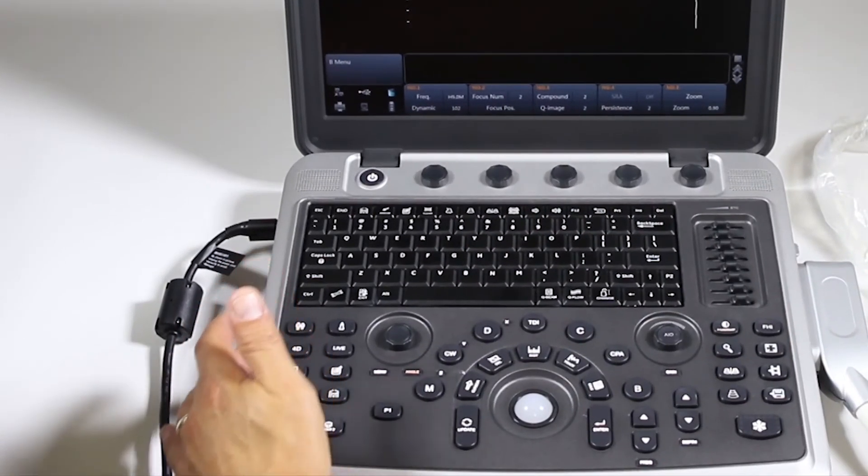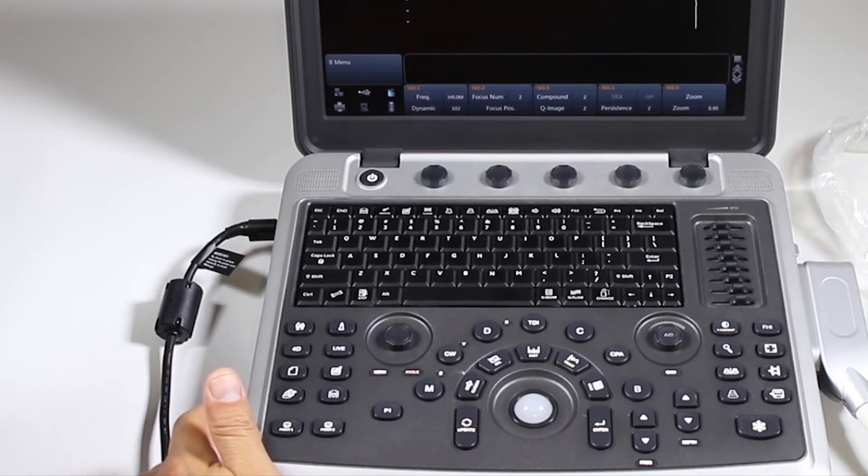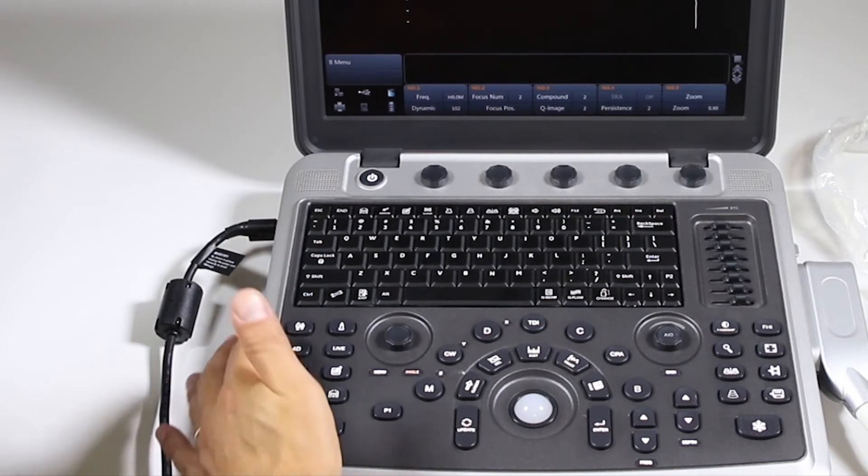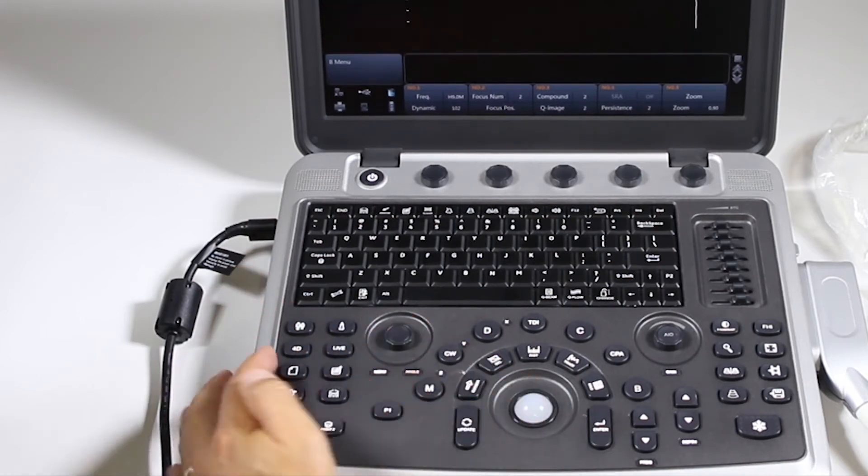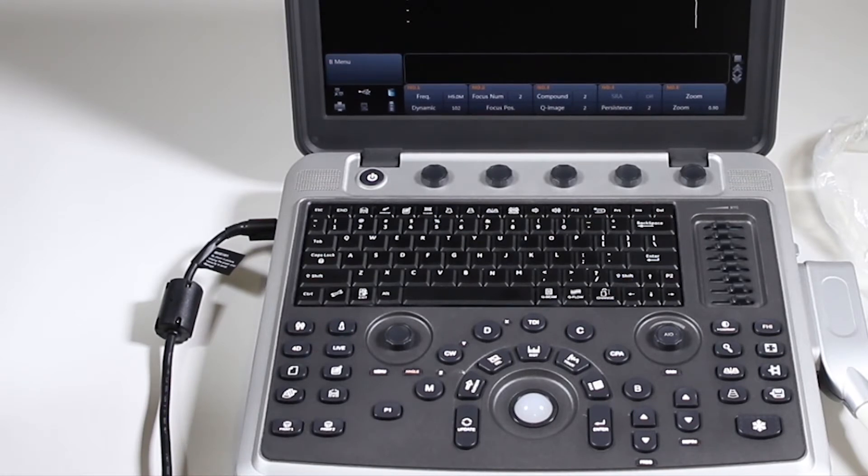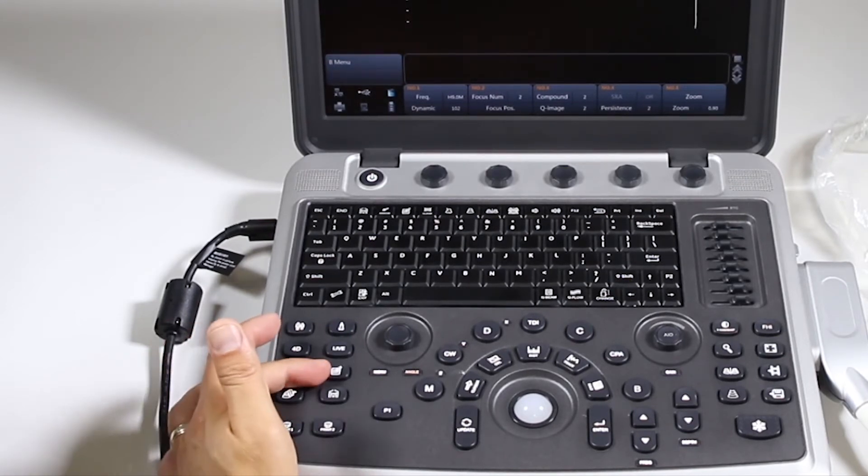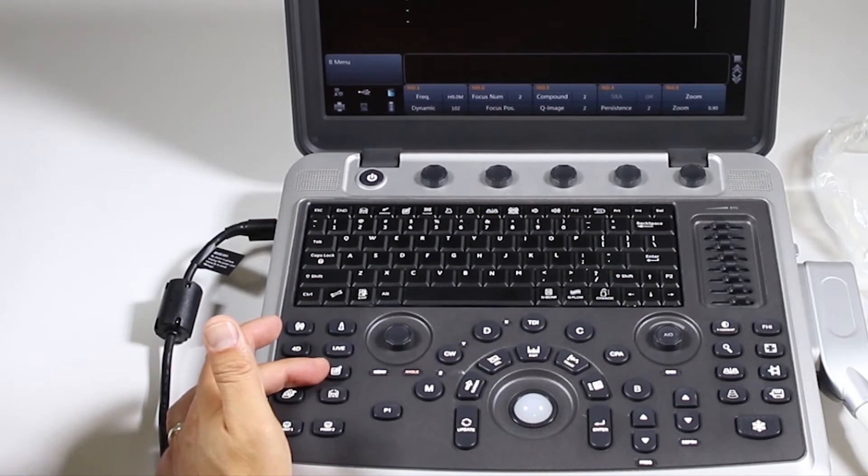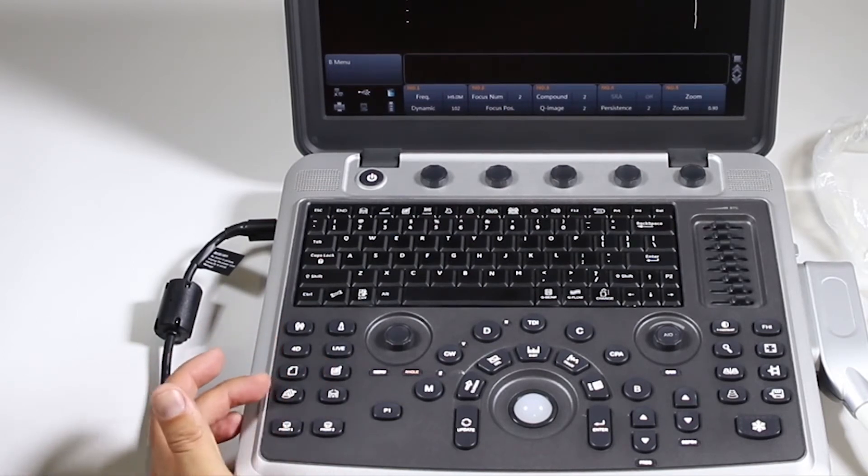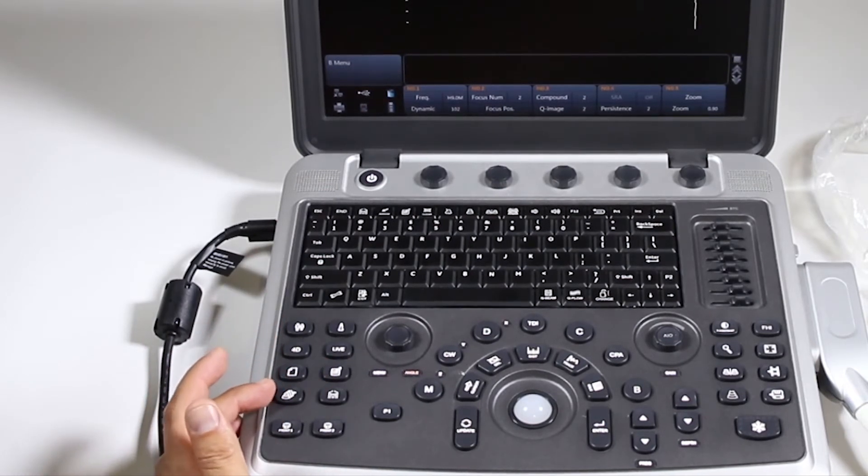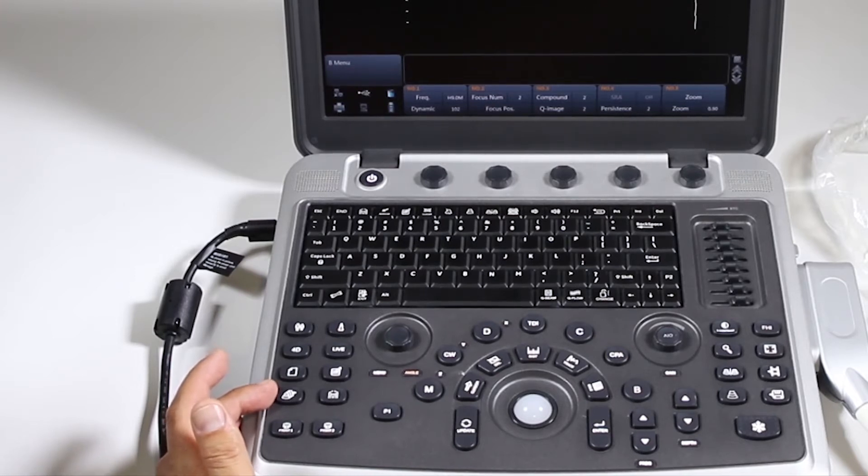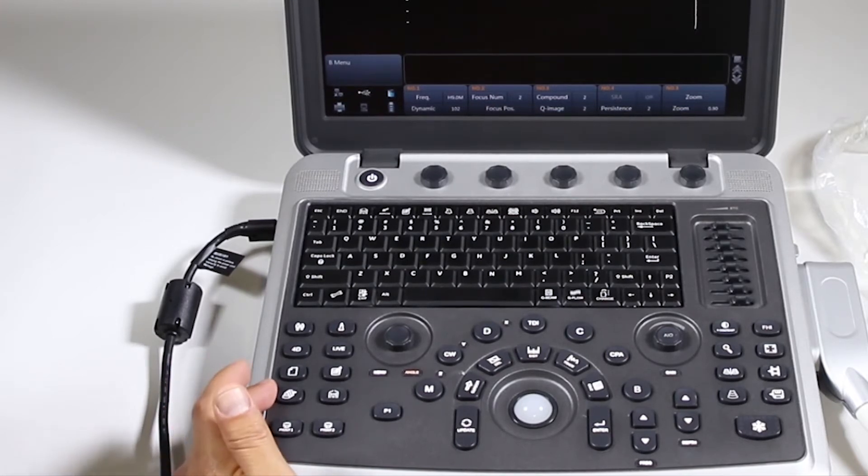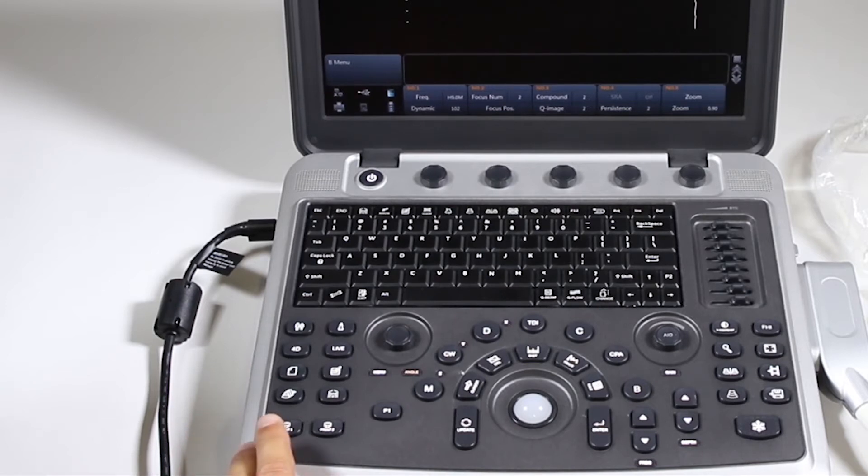Over here, we have our exam function group where you have your patient information, probe. These are for 4D only. There's 4D and live. Those will only apply to 4D imaging. Your report for comments or annotations. Body mark. Archive so you can see the images or go to the patient archive where you see all the patients you've done and take a look at images.